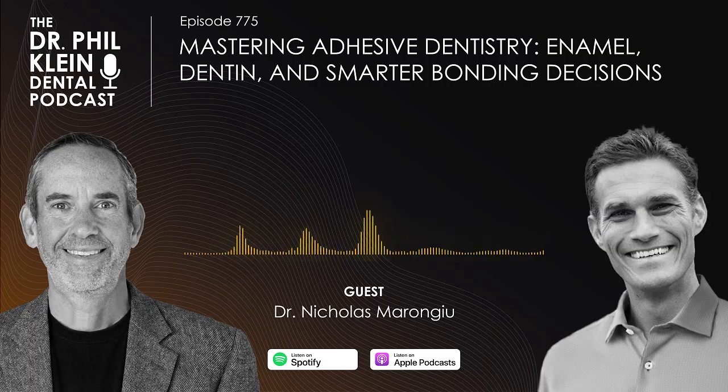What about immediate dentin sealing for indirect restorations? Yeah, so the immediate dentin sealing, I don't use it and I don't rely on it by practice and by way of my process or protocol. I do it on occasion, and I do it when I have an issue, right? We're not perfect. Things will happen sometimes. And if I have the etch gel, if I'm looking in the scope and I see that I've gotten gel or the patient has shifted, something has happened where I've got etch now on the dentin surfaces, I treat that differently. And IDS is one of the things that I will stop and do in my bonding process.